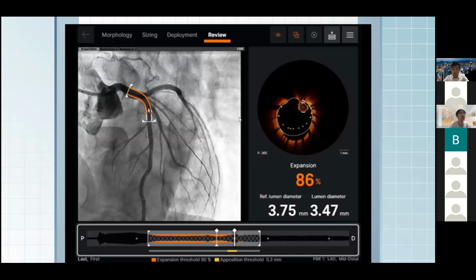So with all these new forms of imaging, as I've mentioned, especially for more difficult types of imaging, such as intravascular ultrasound, it is very operator dependent. But artificial intelligence basically removes that criteria, such that more physicians who are newer in training will be able to interpret the images better.